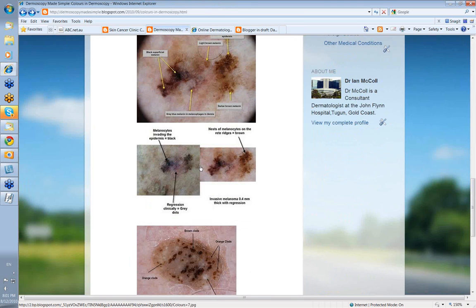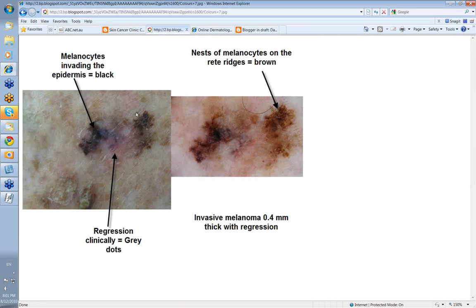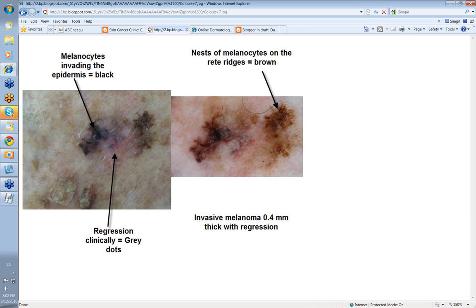Here is the clinical image of that case alongside the dermoscopy we just saw. You hardly need dermoscopy to compare these two — you can almost see the dermoscopy looking at the clinical image. The whitish area with the grey was regression, giving rise to the grey dots we saw. The melanocytes are invading the epidermis here and therefore it's black. And here, nests of melanocytes on the rete ridges give brown. This was an invasive melanoma, 0.4 millimeters in thickness with regression — this pinky-white area with the grey dots where an immune attack has knocked off some of the melanocytes.